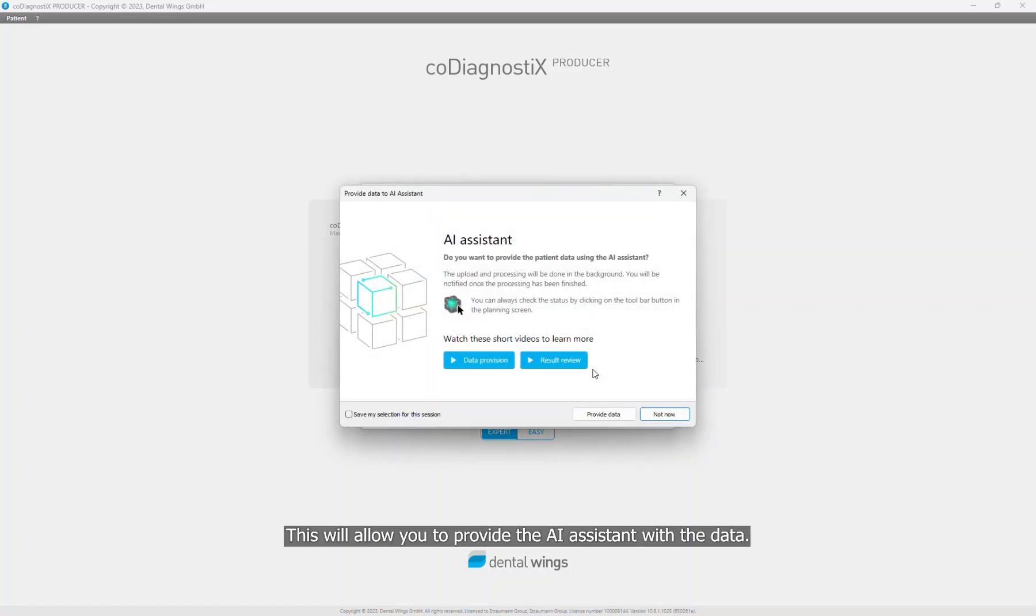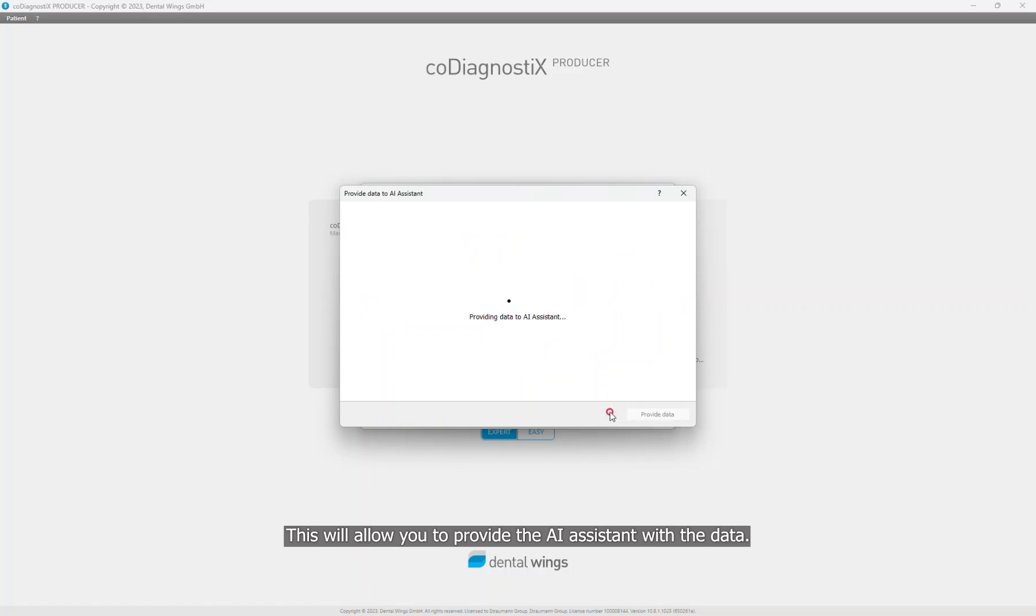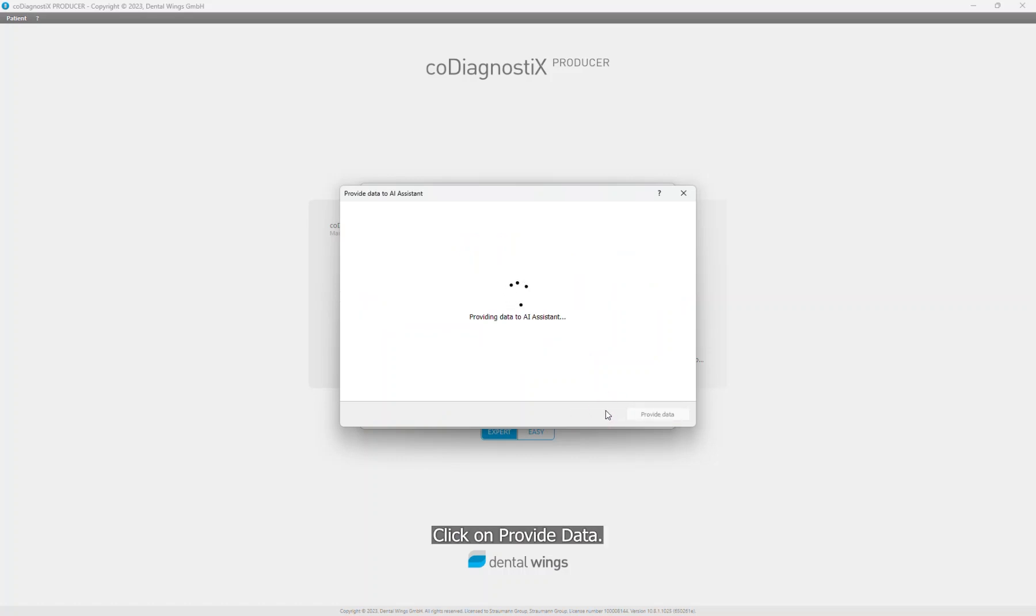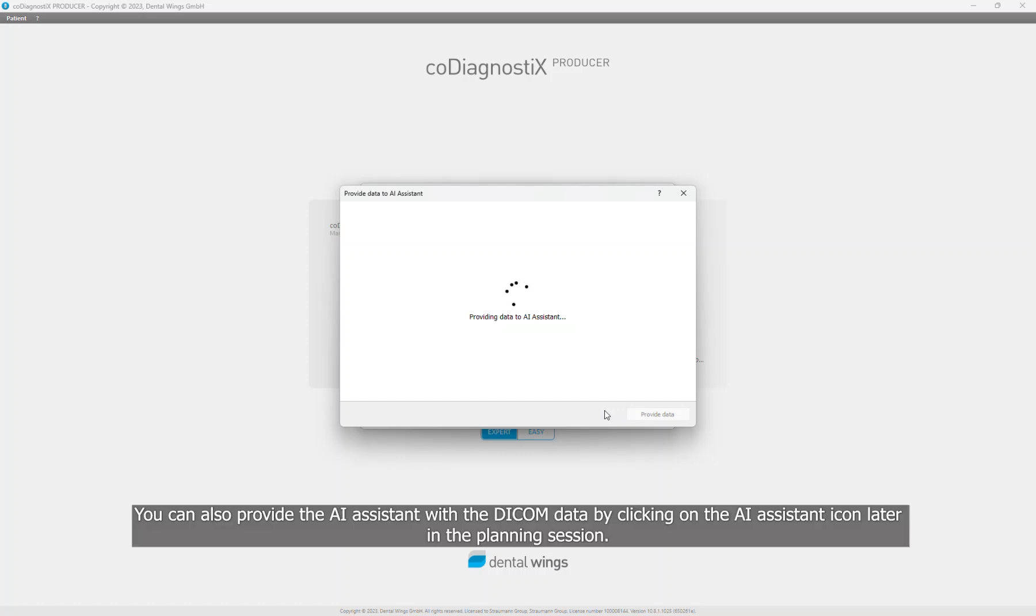Click on the OK button and the dataset will be created. A pop-up window will appear. This will allow you to provide the AI assistant with the data. Click on Provide Data. You can also provide the AI assistant with the DICOM data by clicking on the AI assistant icon later in the planning session.